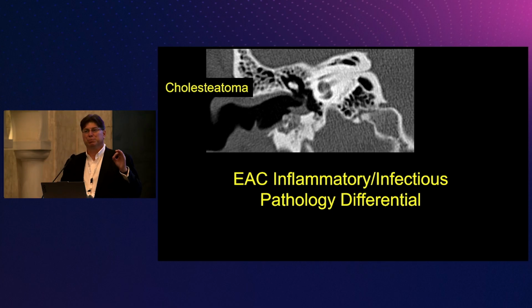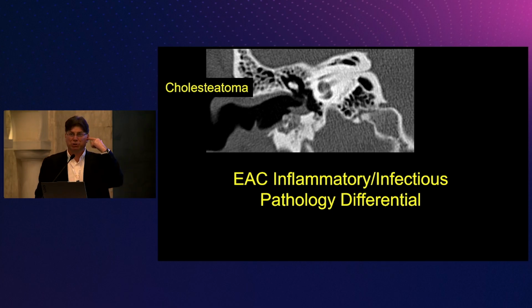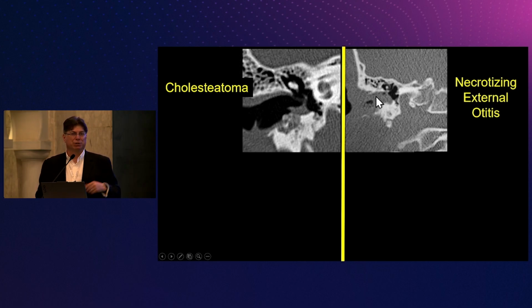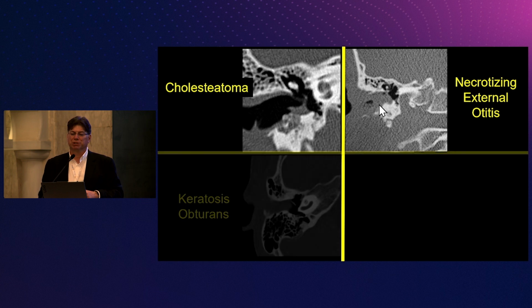Is there anything like debris or a foreign body in the external auditory canal, the ear hole, that might be blocking the sound waves from getting to the TM? If I have scalloping of the inferior EAC, half of the cases have bony flecks left behind, that's a good appearance for an EAC cholesteatoma. If I have an older patient, over 80, say, maybe immunocompromised, often with a Pseudomonas aeruginosa infection, they may get necrotizing external otitis, what we used to call malignant external otitis, and they can get infection that goes down inferiorly through the fissures in the cartilaginous EAC to the parotid. So that's a good appearance for necrotizing external otitis.